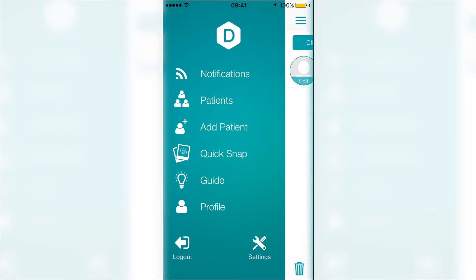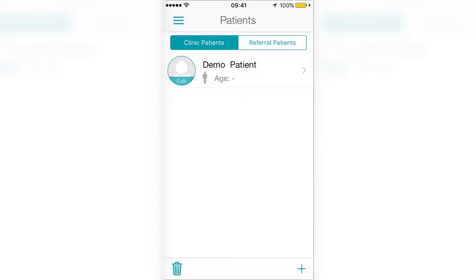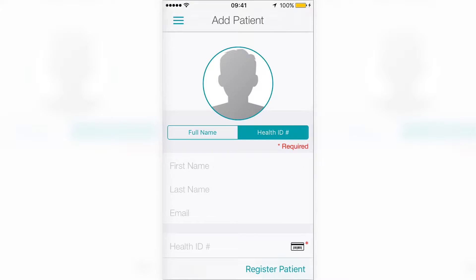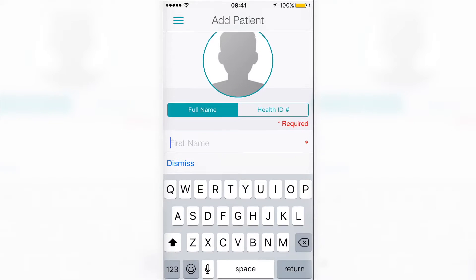From the main menu, tap on Patients to see the list of patients. A demo patient account has already been created for you. On this page, you can add a patient by tapping on the plus sign at the bottom right of the screen. Adding patients is very simple using DermEngine — you can create a patient account with or without a health ID number.